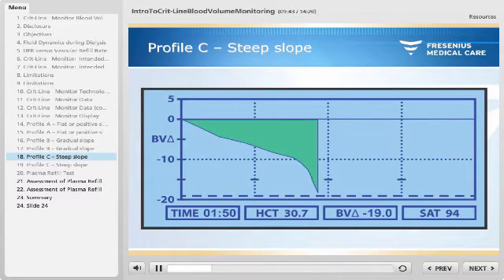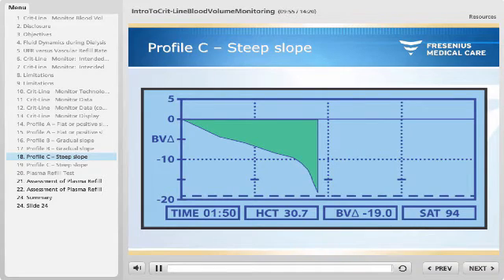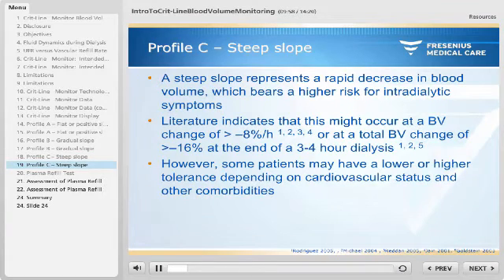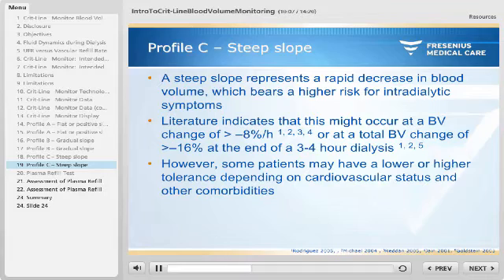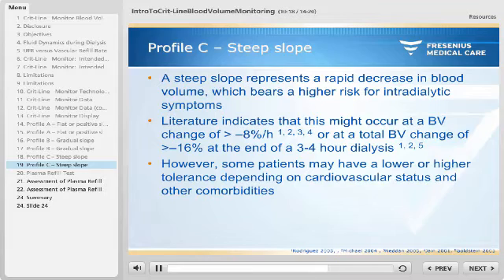The third example shows a steep decline in blood volume after about 90 minutes on dialysis, with a relative blood volume change of minus 19 percent after 1 hour and 50 minutes — representing profile C. A steep slope represents a rapid decrease in blood volume, which bears a higher risk for intradialytic symptoms. Literature indicates this might occur at a blood volume change of greater than minus 8 percent per hour, or a total blood volume change of greater than minus 16 percent at the end of a three-to-four hour dialysis session. Some patients may have a lower or higher tolerance depending on cardiovascular status and other comorbidities.